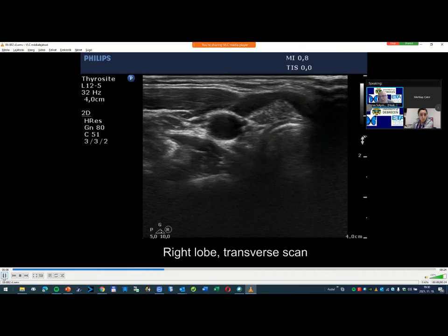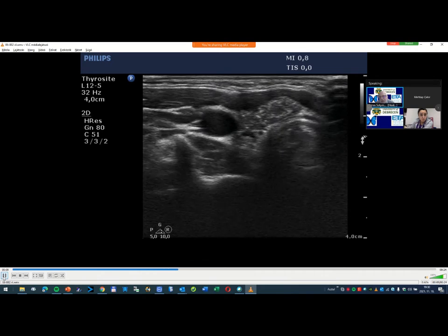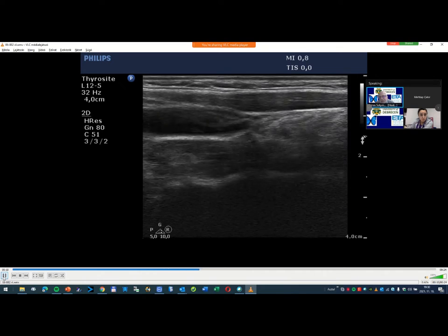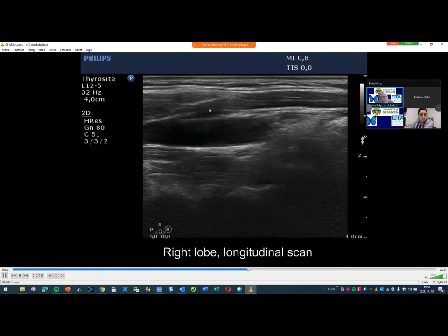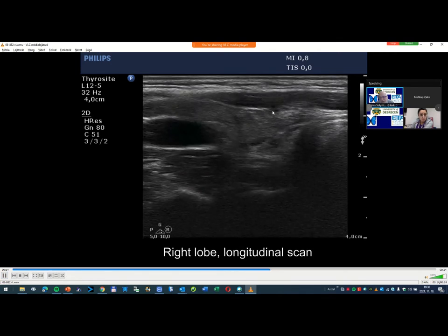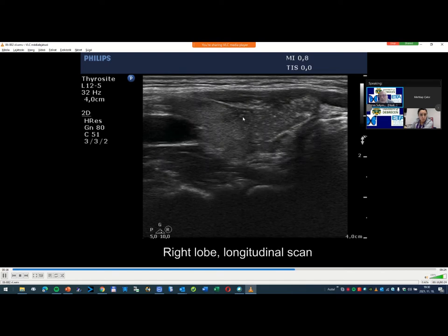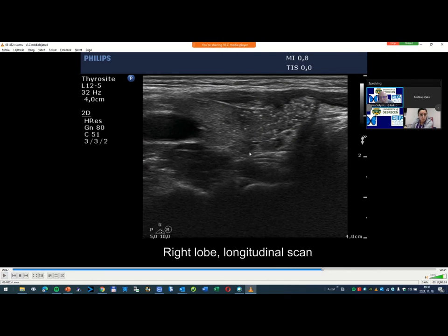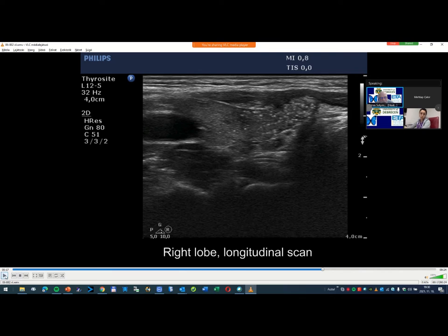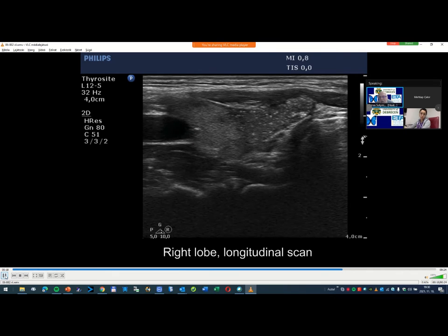The ratio of granules to non-specific linear forms is very high in this case, so these are not comet-tail figures. Here, tiny cystic area; here, another — we can see them — but the entire pattern, the whole pattern, is very characteristic.